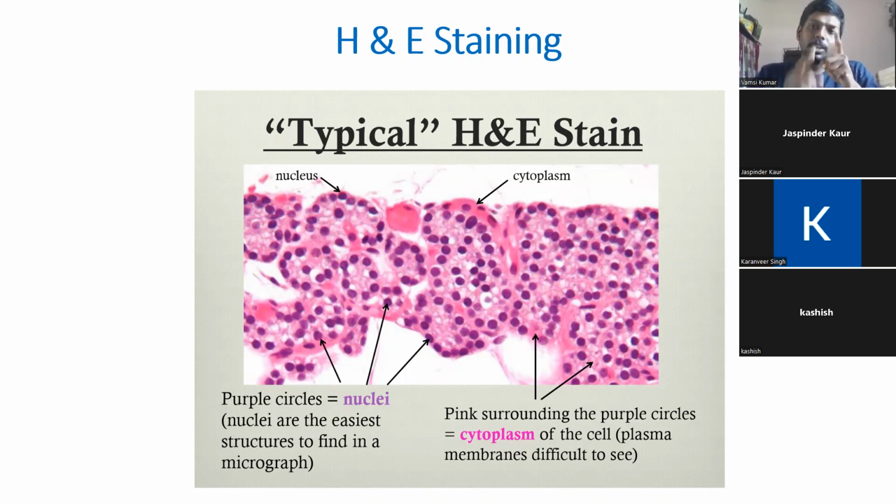So I will develop an anti-CXCR5 antibody and allow this antibody to bind on this antigen. And how will I identify this antibody? This antibody will be labeled with a chromogen that can give color to me.